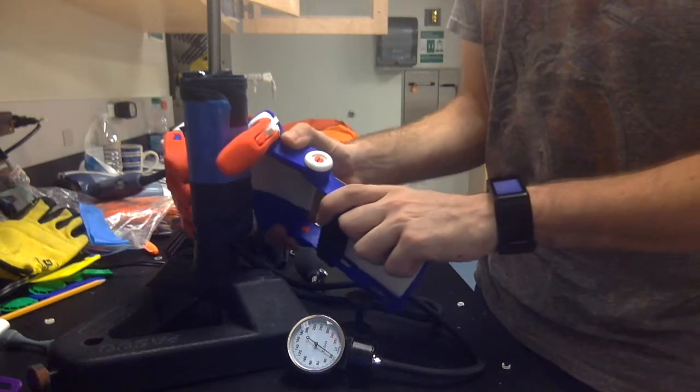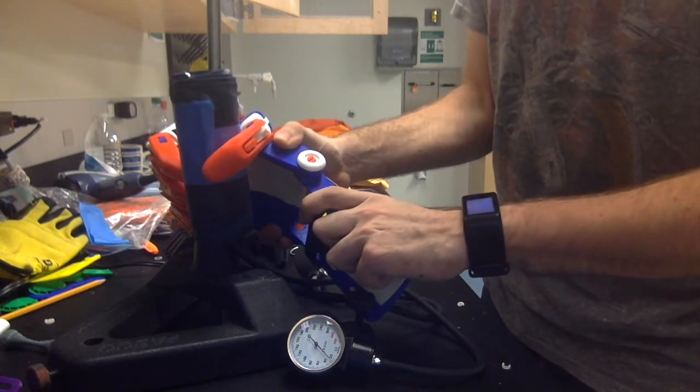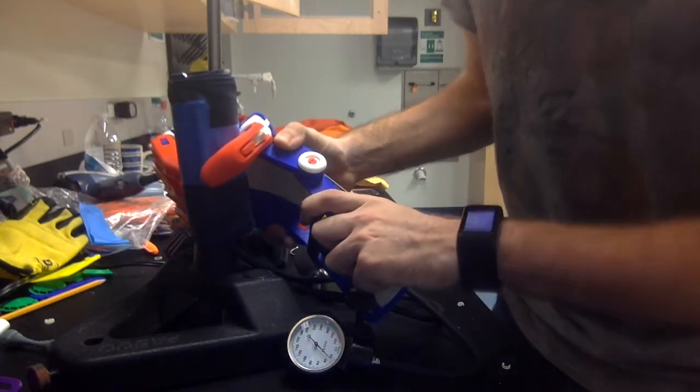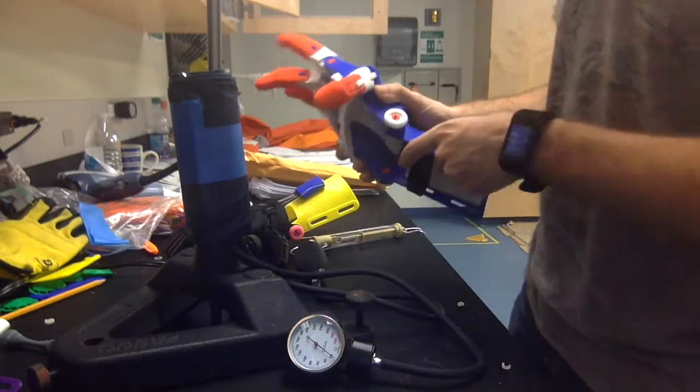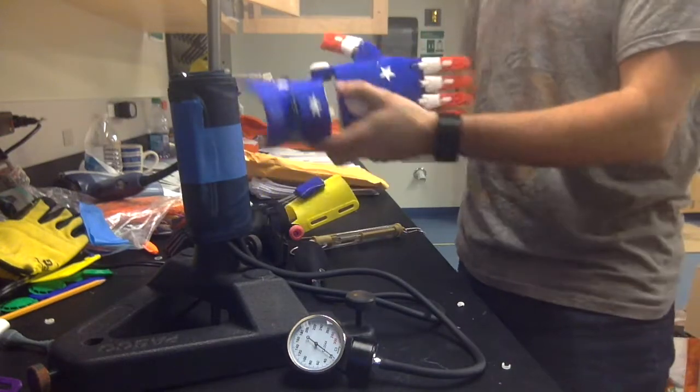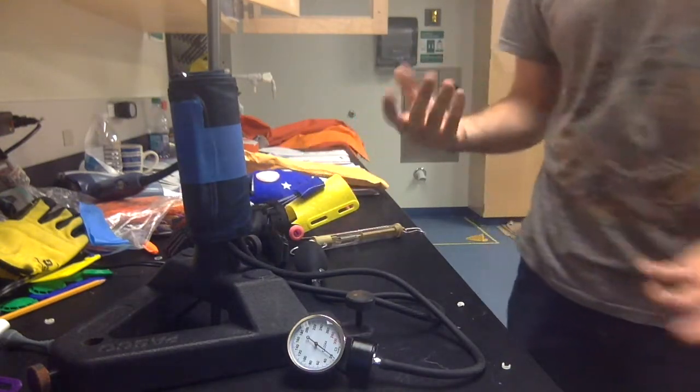And we're going to squeeze. And we see that we get about 10 millimeters of mercury out of the Phoenix hand. So that's basically the grip strength.